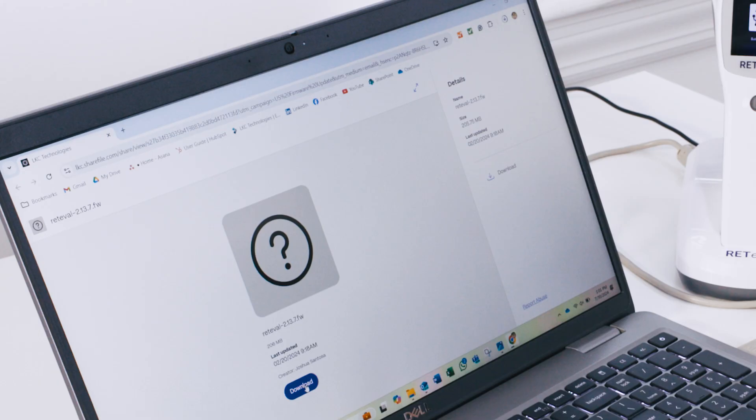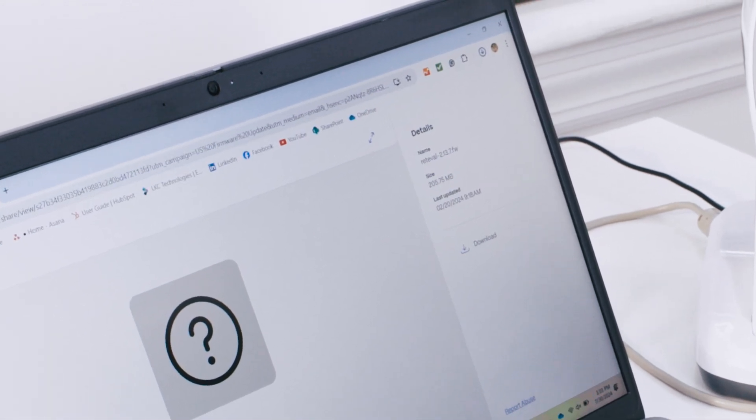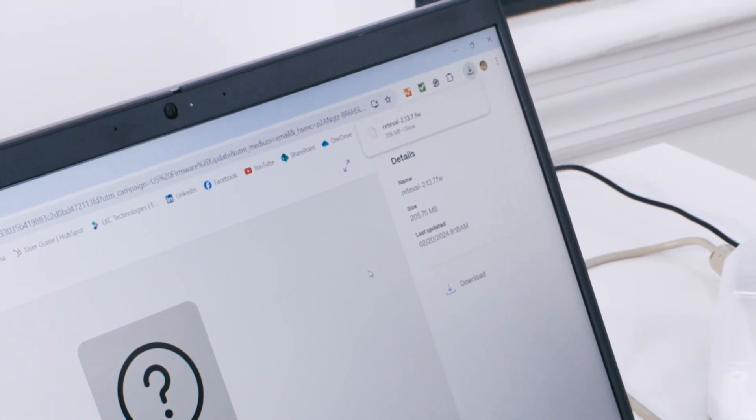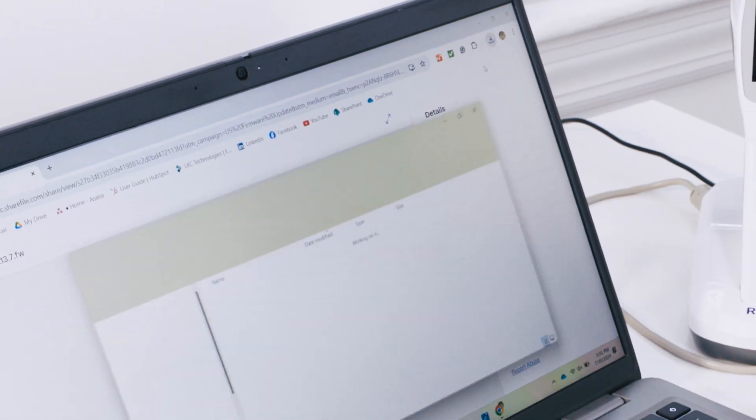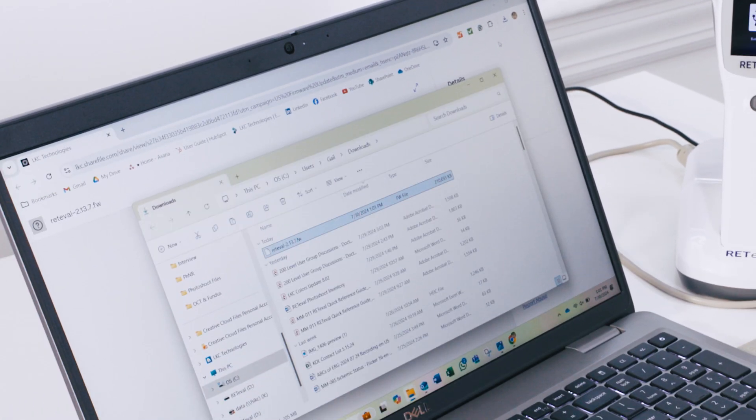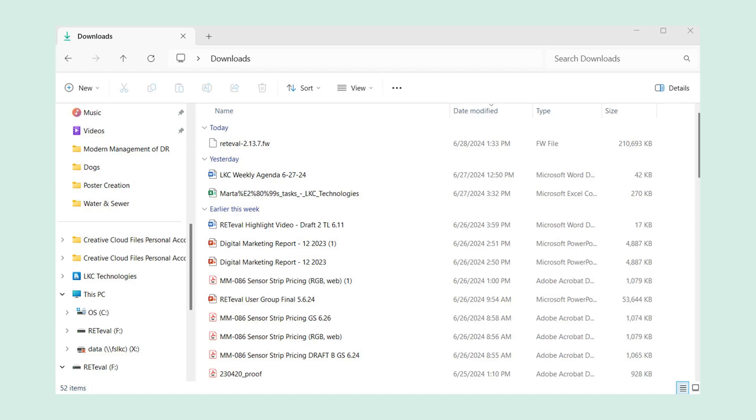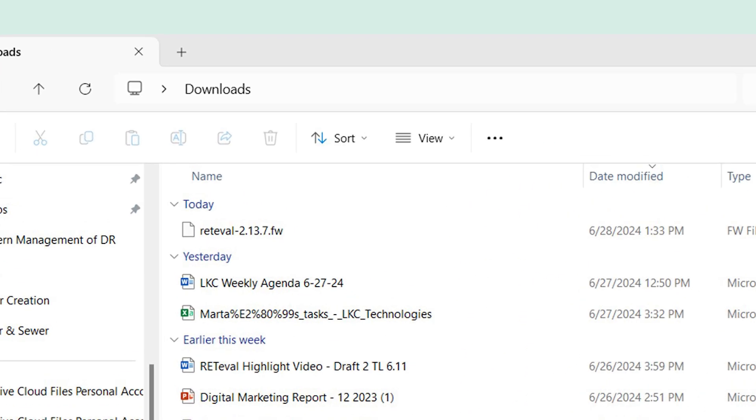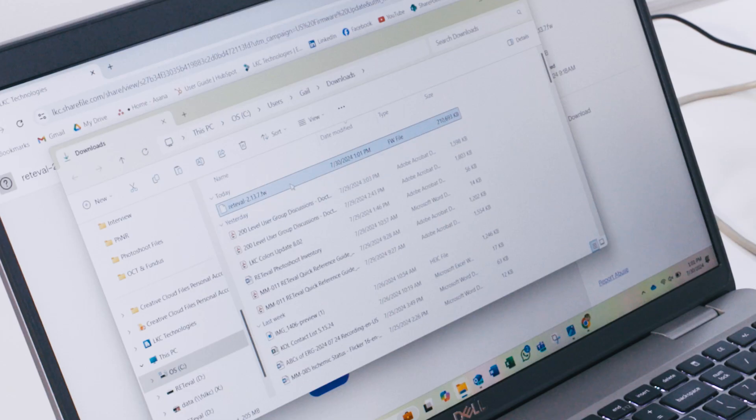This may take a few minutes. Once the download is complete, navigate to the downloads folder where you will find the downloaded file. This can be done by selecting the show in folder option after the download or simply by navigating to the appropriate downloads folder in the file explorer.